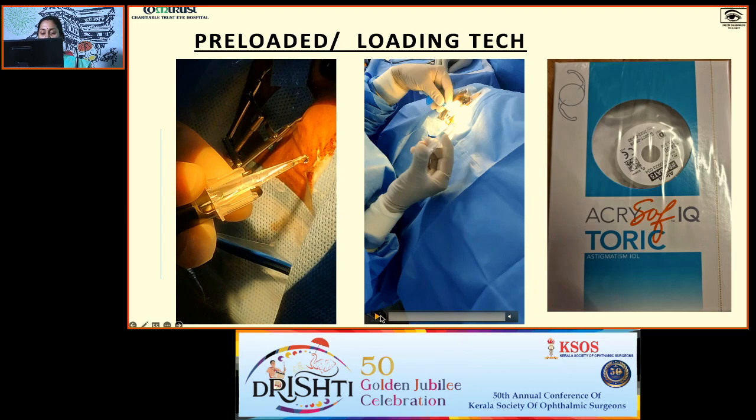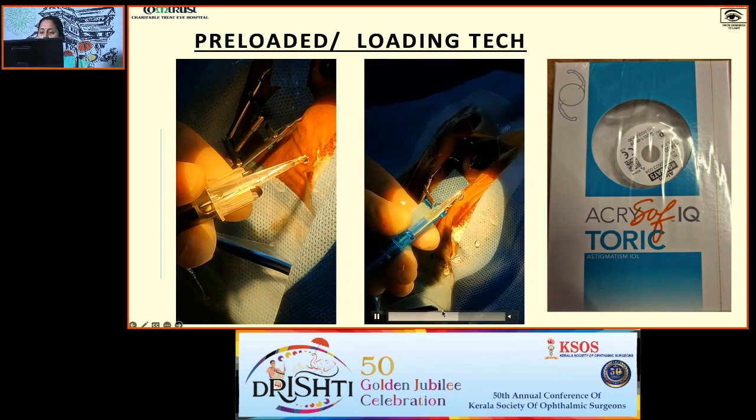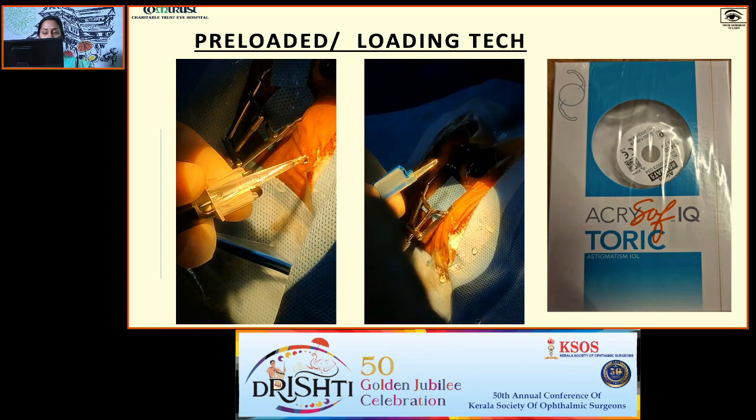This is an Indian system, Suprafob, that is loaded as per the instruction. Through the nozzle, saline has to be injected, and visco has to be injected through the nozzle and from behind. The flaps you can see have to be closed by removing the central flap separator. Once it is ready, you can check the movement of the lens by pushing the plunger.